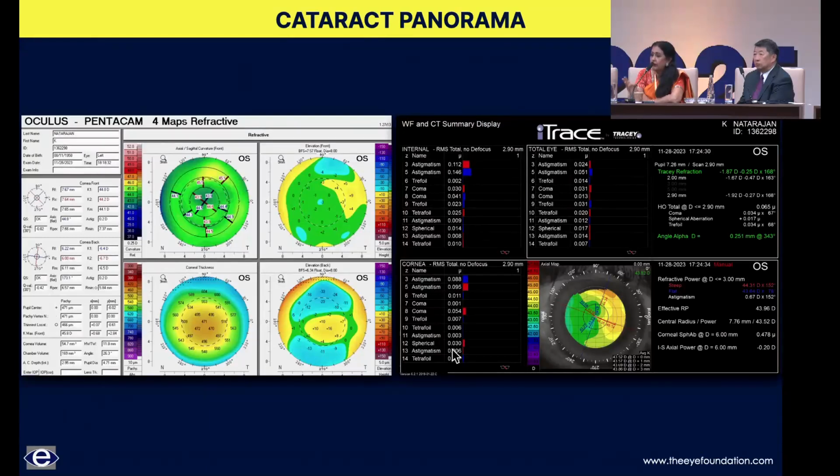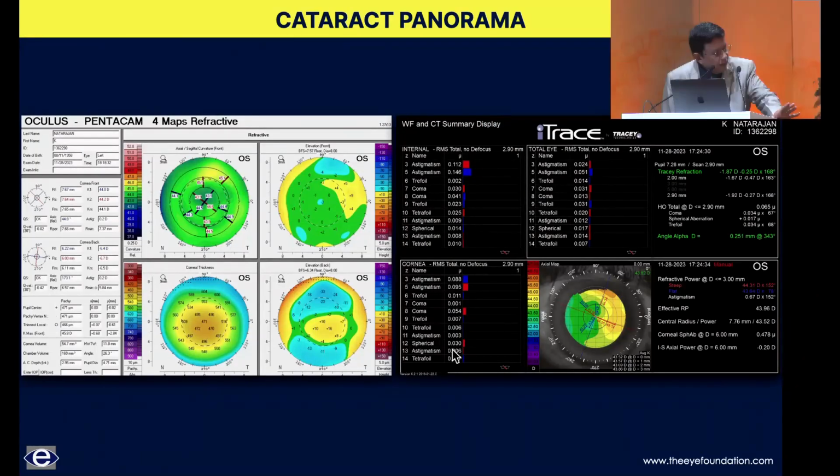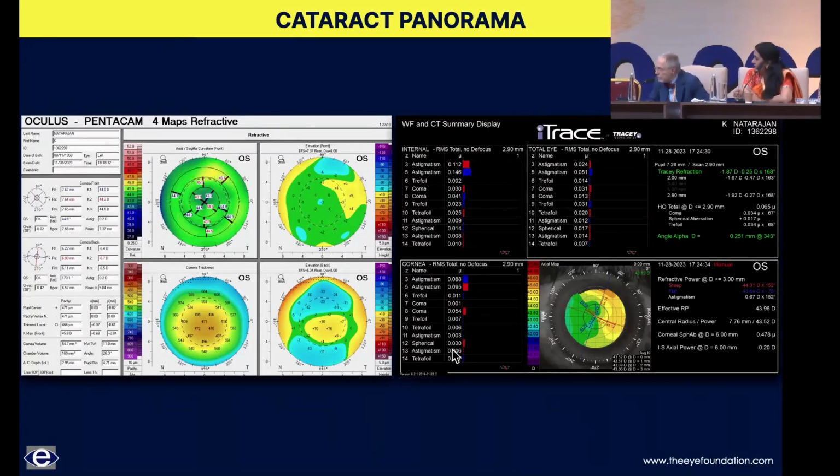Of course, the dry eye status issues also have to be looked into. We don't have light adjustable lenses. So, when you said a CRV, continuous range of vision, what lens was it? Synergy. Oh, the Synergy. Well, that's courageous to put a Synergy in a post-LASIK eye, because the Synergy is very particular to the accuracy of the refractive outcome. If you're off a little bit, patients will often complain.